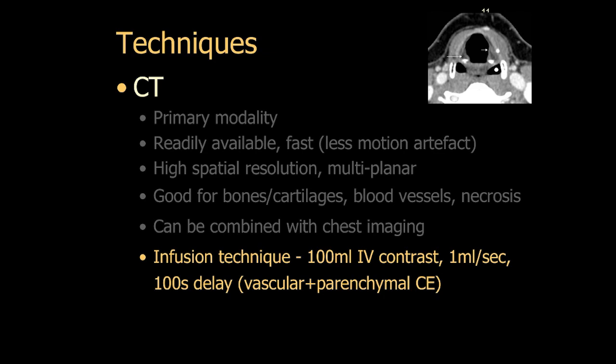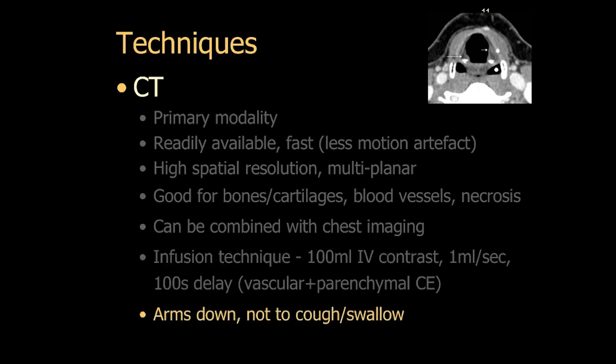At our institute, we use an infusion technique in which we inject 100 mL of contrast at 1 mL per second, followed by a 100-second delay before scanning. This provides us with an optimal combination of both vascular and parenchymal contrast enhancement. The scans are performed with arms down.